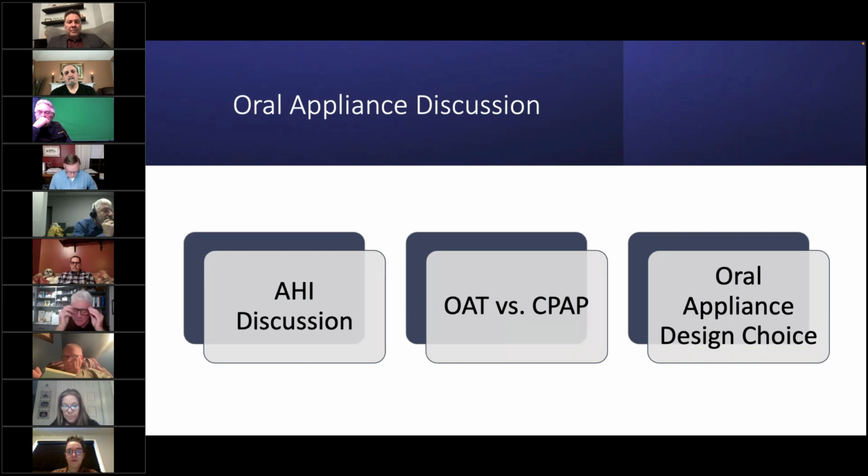I've got to be honest, I've heard a lot of courses and a lot of people talking about how to choose which appliance for that individual patient, and I find that almost all of it is less than anecdotal. It seems logical when we start talking about vectors and forces on teeth, but it really doesn't seem to be an issue. We've used an anterior midpoint stop appliance with a tap on lower anterior teeth from canine to canine that were loose without loosening them further. So to suggest that is necessarily a problem is incorrect.